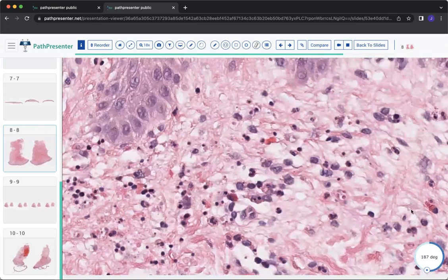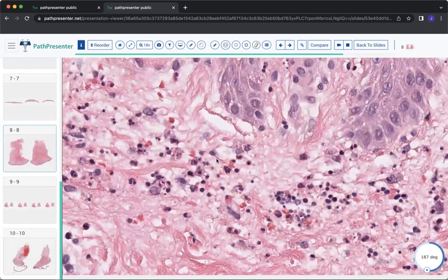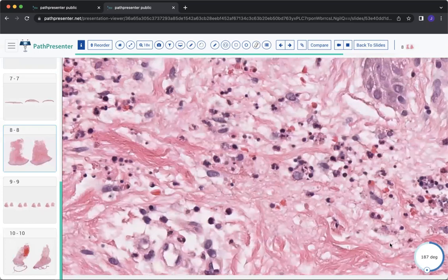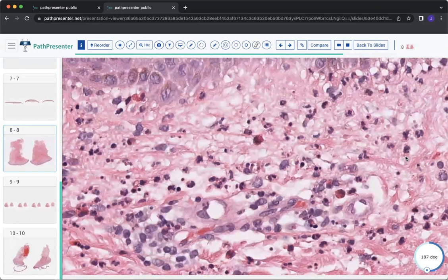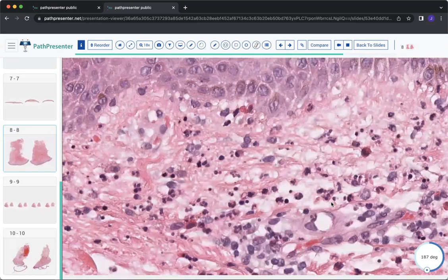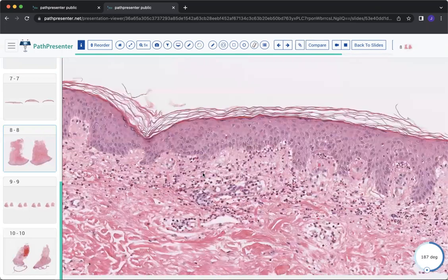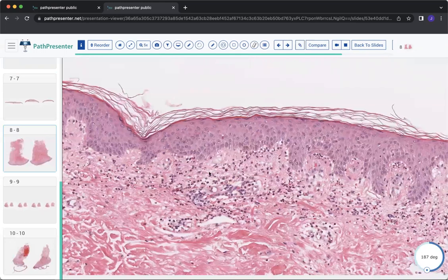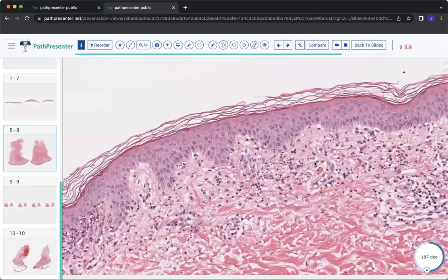So the eosinophils remind you, because you'll see more eosinophils in this entity probably than you will see in dermatitis herpetiformis, but sometimes you can see a lot of eosinophils in DH as well, so you wouldn't want to rely on that completely. In fact, if they put DH and linear IgA bullous on the answer choices and they didn't give you a DIF pattern, then it would be tough to definitively say.